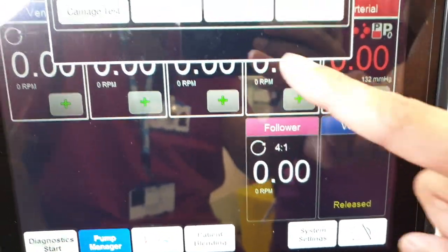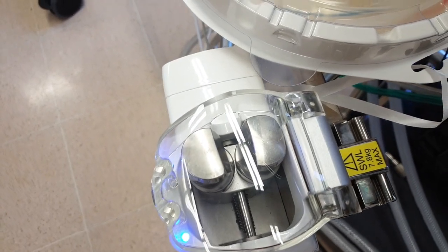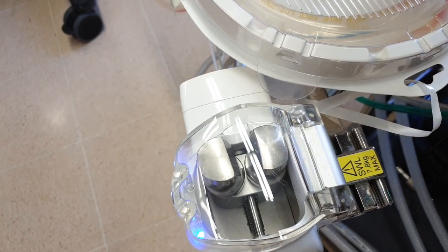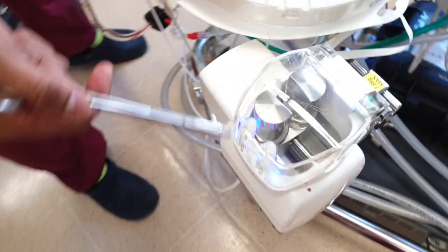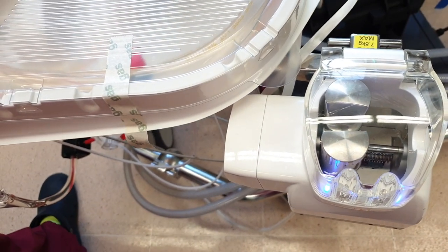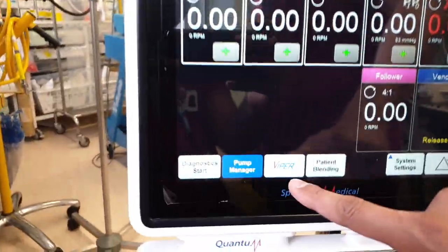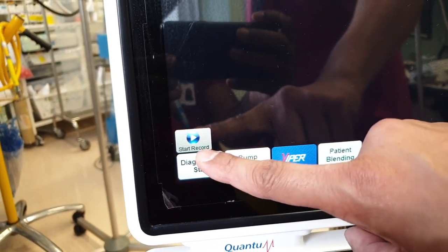Always do the occluder test without anything. Make sure it will move like that, and it's open, ready to receive the tubing. These blue lights are not blinking. That means you are good, all set, ready. If it's blinking, something is wrong. So, it's actually Viper. Put your patient's data, hit the Viper, and then start record.